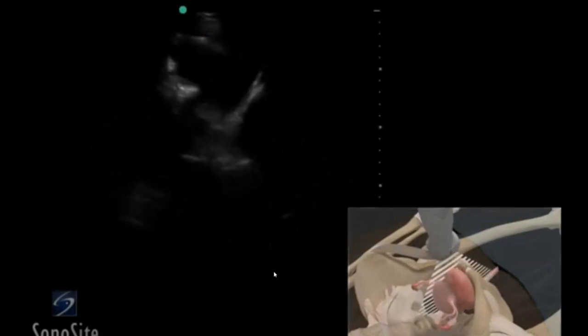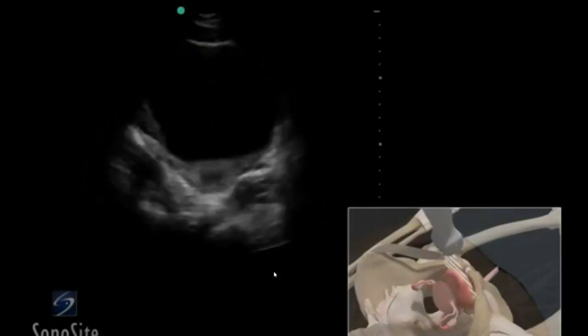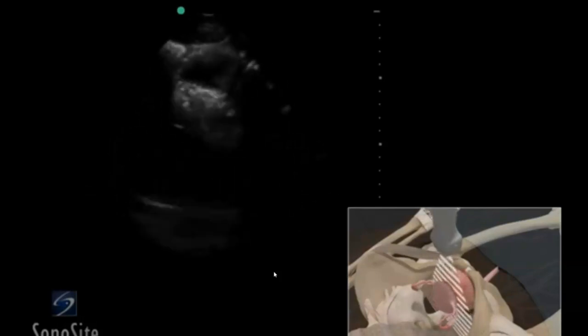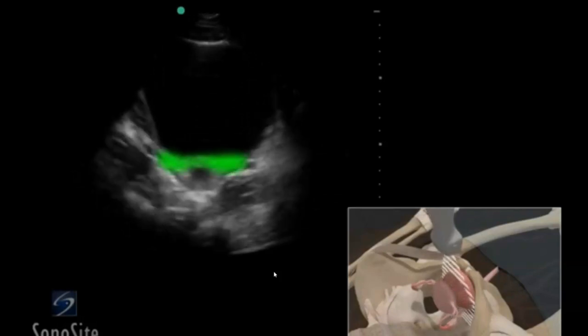fan through the pelvis, assessing all over for fluid in the pouch of Douglas, which is also known as the recto-uterine pouch in a lady, or the recto-vesicular pouch in men. A full bladder may cause what's called posterior enhancement, so therefore the gain may need to be lowered for proper visualization.